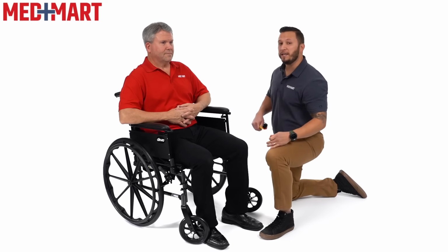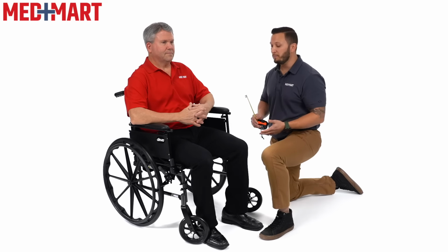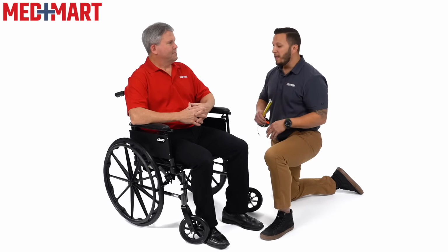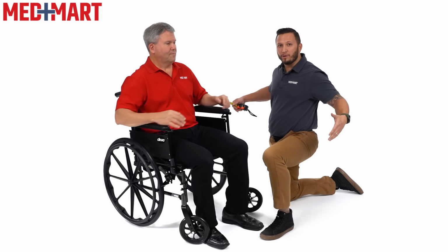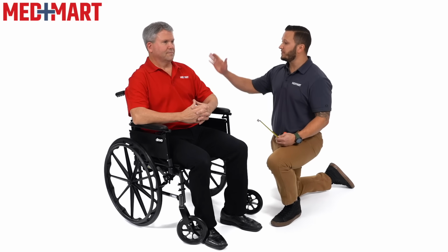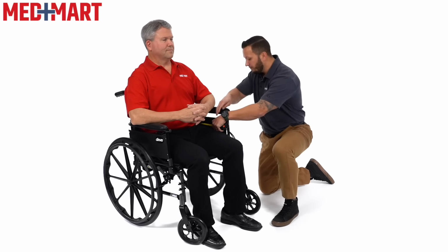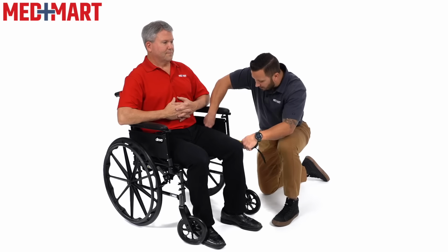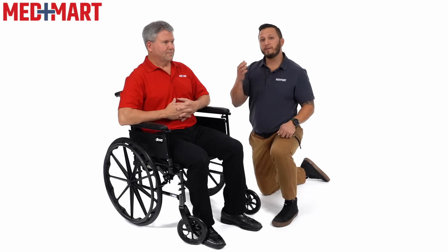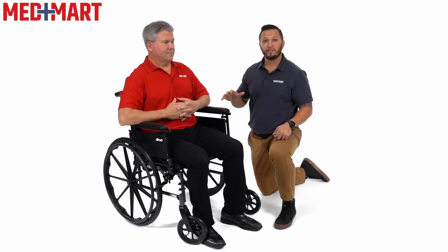Coming in at about 17 inches, finding the widest point of his hips tells me that he should be in an 18-inch wide chair. The reason why you don't want to go too wide is because then it makes it a little bit more challenging to fit through doorways, as well as widening your arms and making it difficult to self-propel. The next thing I'm going to do is make sure that Jeff is sitting up nice and straight with his buttock all the way up against the back of the chair. And I'm going to find the back of that chair and then measure down to behind the knee. That measures right in at 20 inches. When I subtract the 2 inches from that 20, that gives me 18 inches. And so an 18-inch seat depth is appropriate for Jeff.